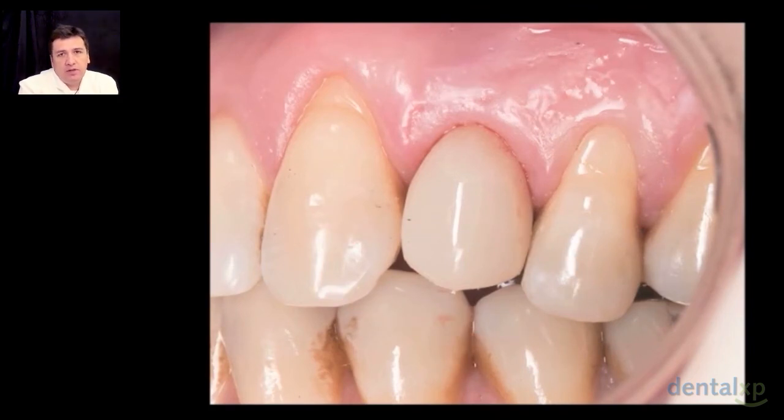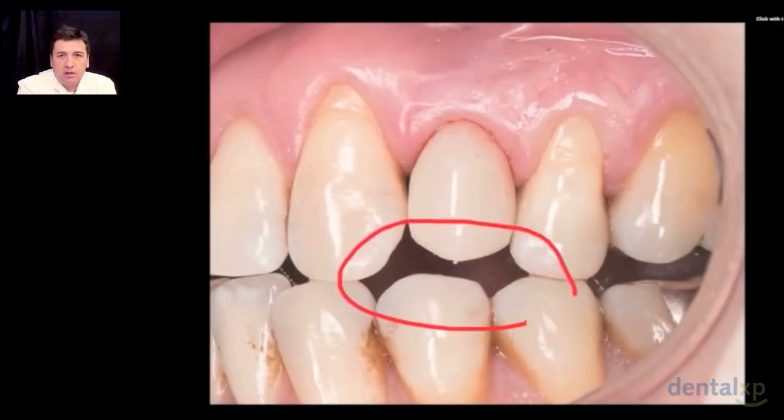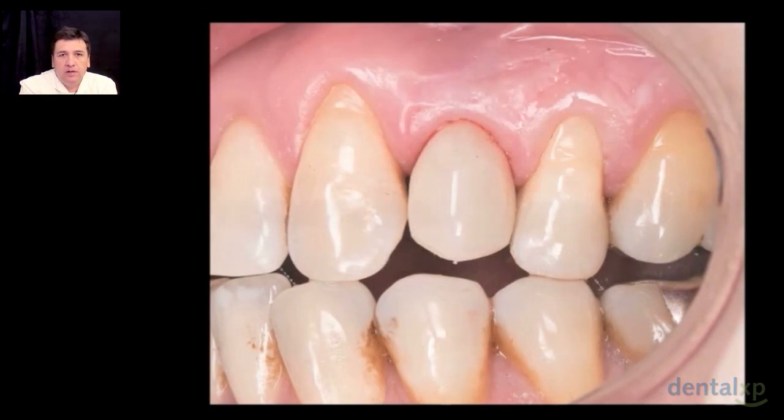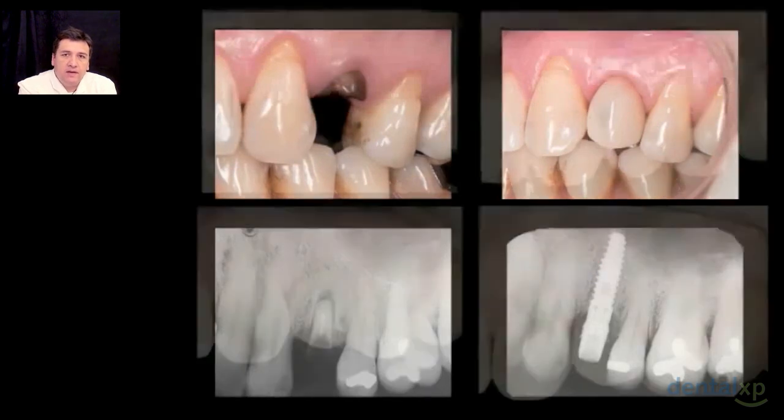What is very important is not to forget that we are doing an immediate crown placement, an immediate connection, so we have to avoid the contact of that crown in the lateral movements and also in the interocclusal relation with the opposite jaw. And with those issues in mind, we can pass from the situation that we are seeing on the left side to the right side.